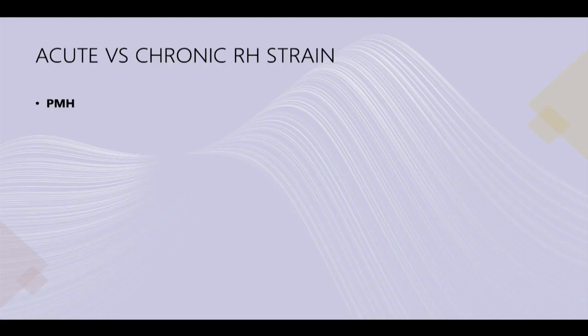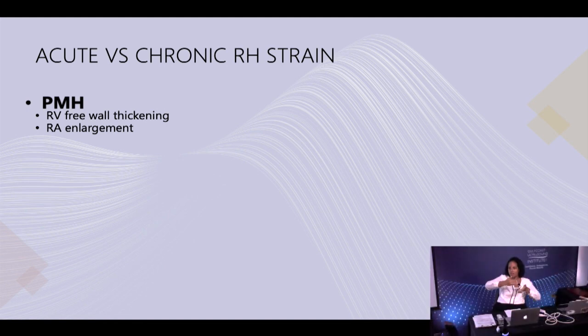So obviously, we talk about the right heart strain sign, and we've been talking a little bit about how to determine whether it is acute versus chronic, but other things to take into account is past medical history. Like I mentioned earlier, our patient was altered, and we weren't sure we were dealing with something acute in this picture, but once we stabilized her a little bit, we were able to obtain a little bit more information, and we learned that she actually has a history of pulmonary hypertension, which was probably the source of her heart strain in this situation. And we also probably know that because her right atrium was very, very enlarged, meaning there was some sort of time that went by that allowed for that right atrium to enlarge to accommodate that increase in pressure that was pretty much flowing backwards in the wrong direction, if that makes sense.